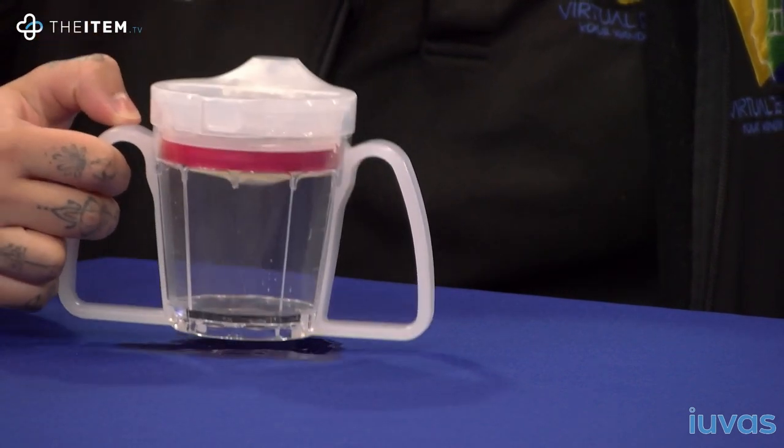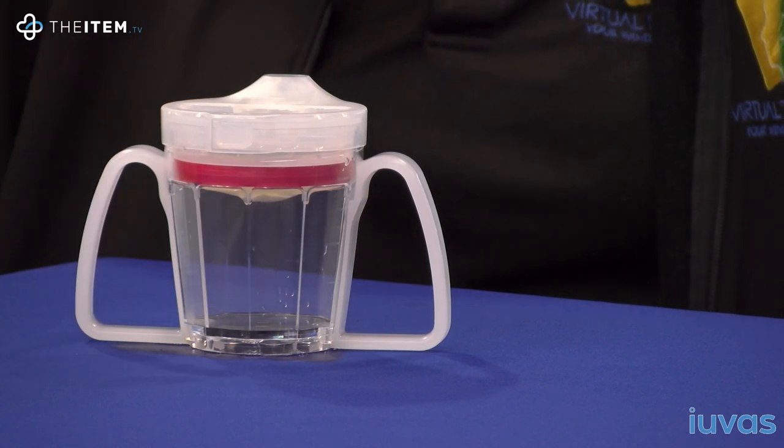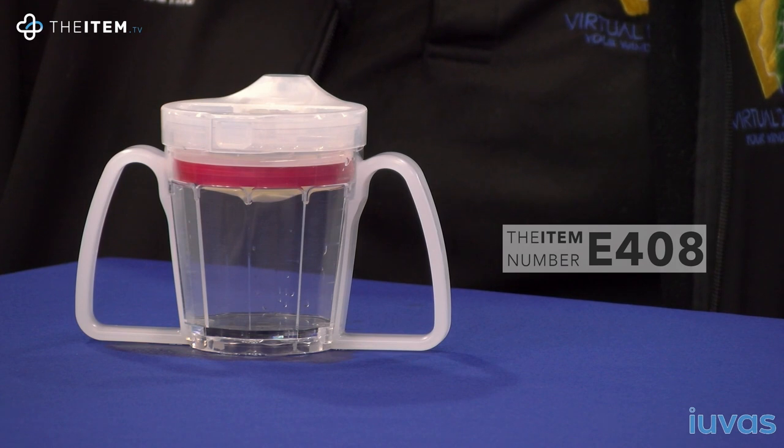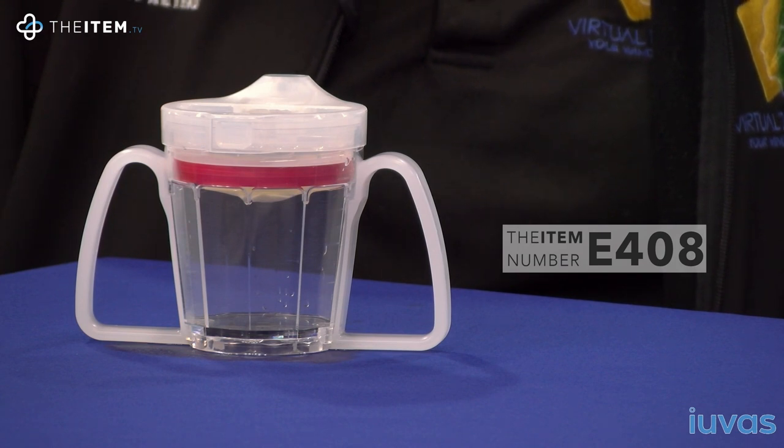The Sipper Cup is designed to achieve the safest way to drink for people with dysphagia and other swallowing disorders. Item number E408, the Sipper Cup, from item.tv, the UK's only distributor.